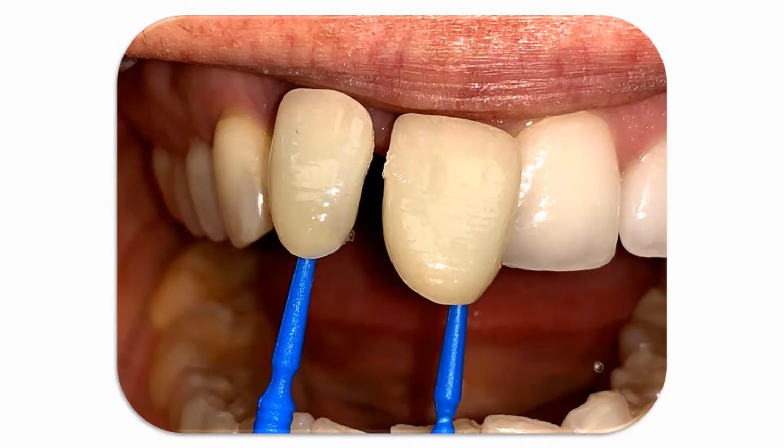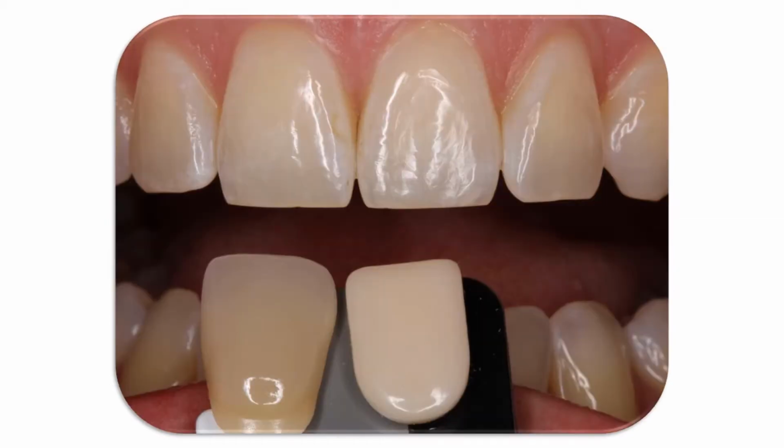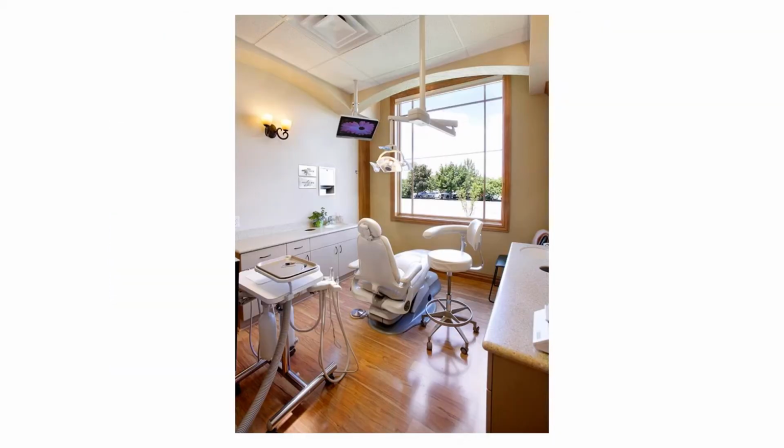Now we're ready to take photos, but before you do, we want to do a check of our environment around us to limit glare. Glare or highlights on the shade tabs and or teeth is something that you don't want. You'd be surprised where that might come from. For example, a big window. A lot of times when the patient is facing a big window, you see big squares of reflection on their teeth and also on the shade tab. What do you do? You draw the blinds, okay?